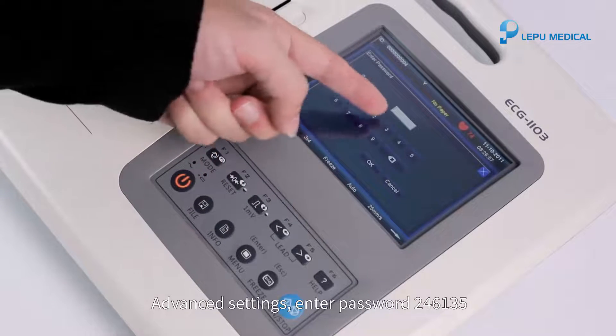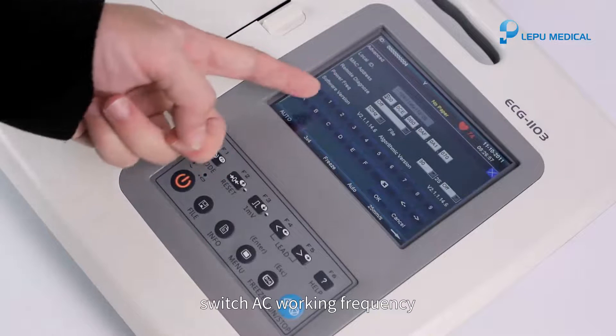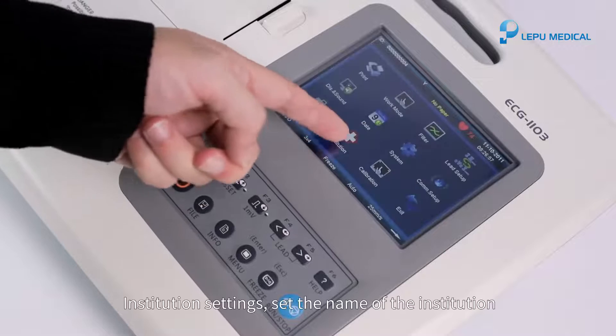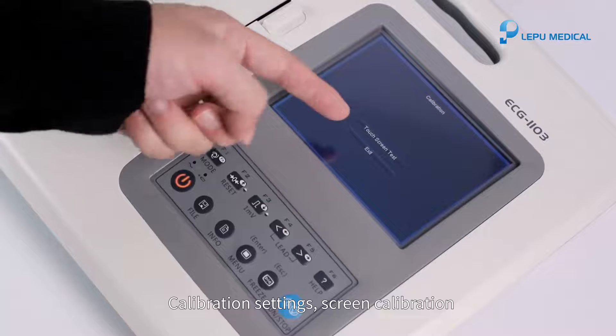Advanced settings: enter password 246135. Switch AC working frequency. Institution settings: set the name of the institution. Calibration settings: screen calibration.